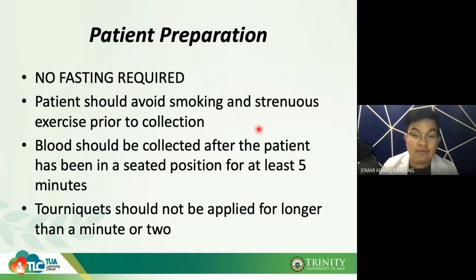Second, the patient should avoid smoking and strenuous exercises prior to collection. Why? Because smoking, your nicotine in particular, can affect your cholesterol. Strenuous exercises can affect your posture, thereby affecting the levels of your cholesterol.